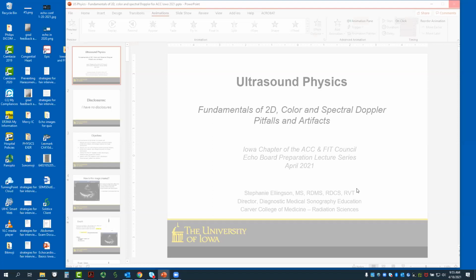With the Doppler signal, what you want to remember is that the amplitude of the Doppler signal, the brightness of it, is related to the number of red blood cells that are moving that speed. So if you've got AS, for example, you're going to get a bright signal of lower velocity with the continuous wave that identifies the LVOT.